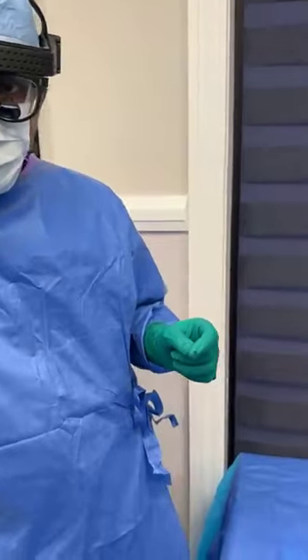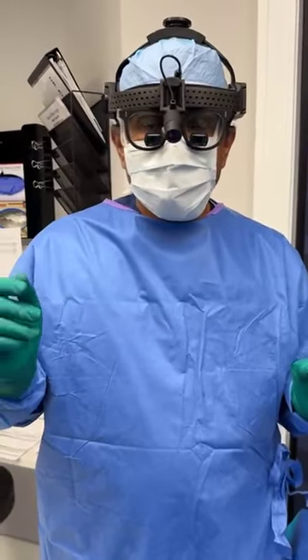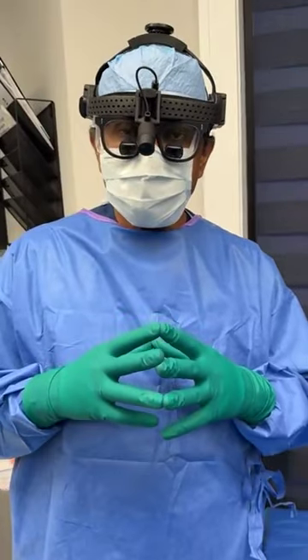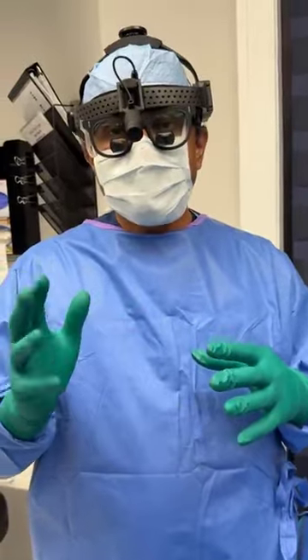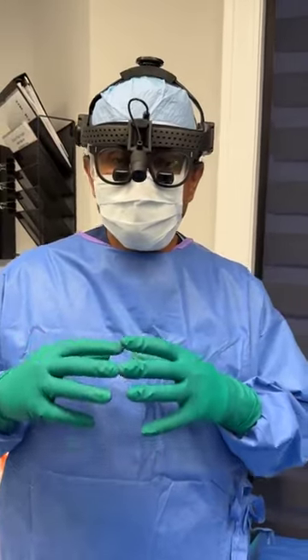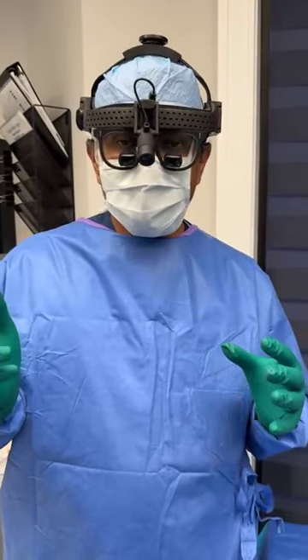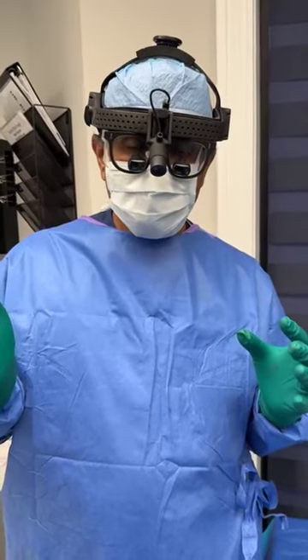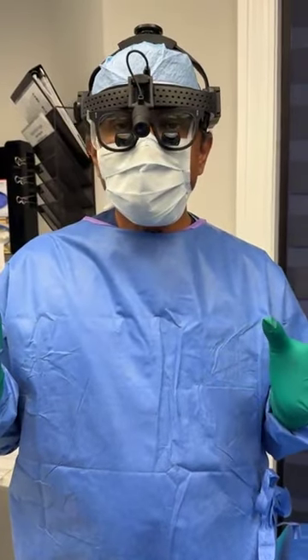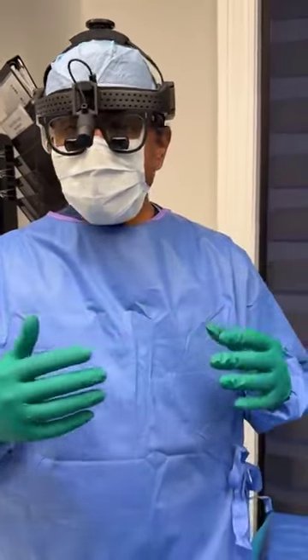So as you will see, this is a very interesting case, and this is what I say is the worst case scenario. She got her implants in 2011, which were saline below the muscle. And then because of her symptoms, she ended up getting an explant in February of 2024, and her symptoms post-op continued, they persisted. And so now, in August 2025, she comes to me with the complaints, 7 out of 10 of what are symptoms suggestive of breast implant illness, and pain on the left side.